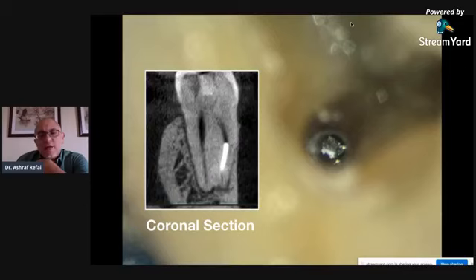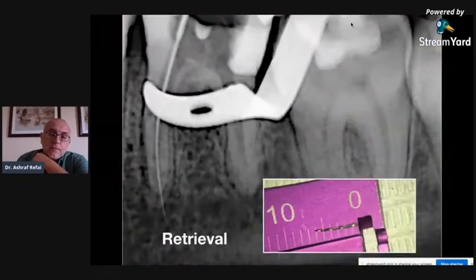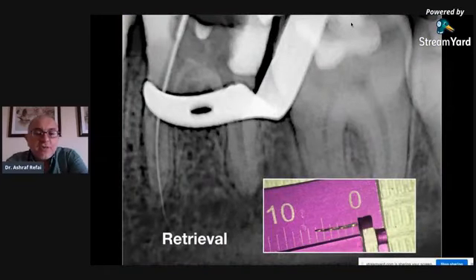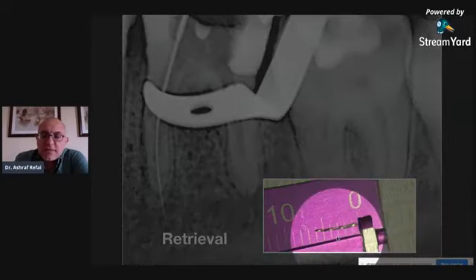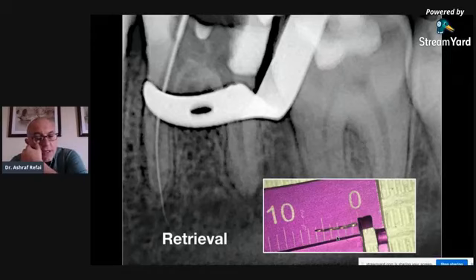And somebody would say, why didn't you bypass? I did. And the referring dentist tried to bypass, and he was unable to get any further than that. And after trials at retrieval, you can see here an X-ray showing me bypassing the instrument and actually overextended into the apical area. And that picture shows the segment. It's about a 6 mm segment of a martensitic rotary nickel titanium instrument. And I was fortunate enough to be able to remove it.